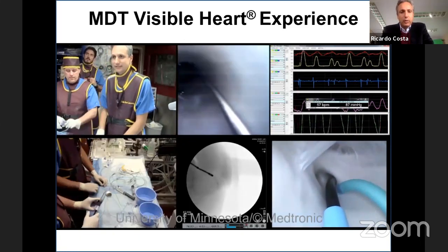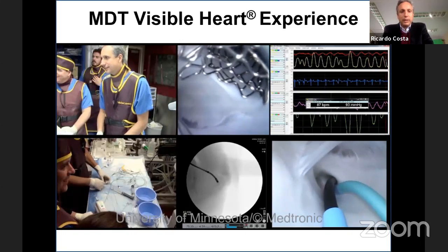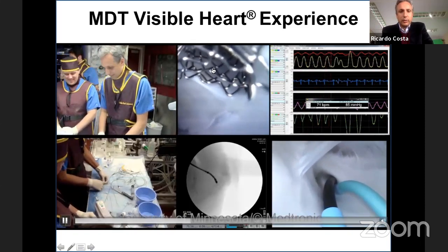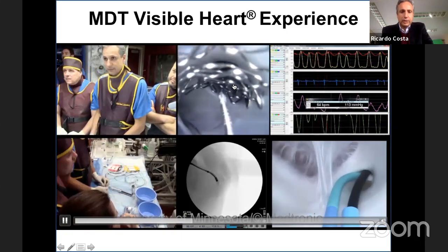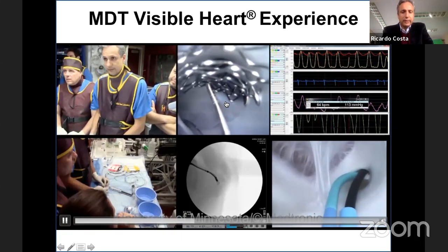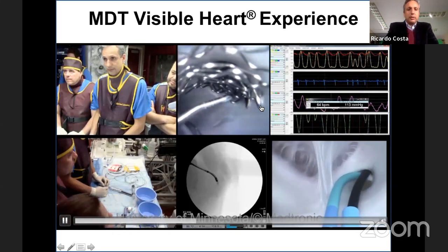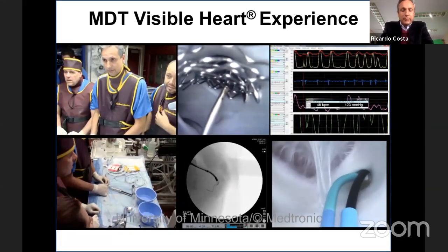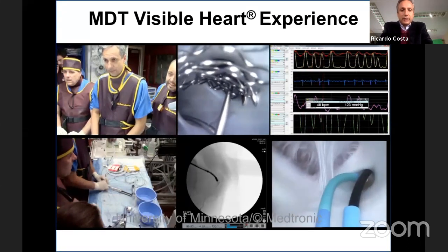So here now we have a complete crush, and that's where you see the ostium on the side. So this is a rewire, and that's the step that probably you're going to take. You might take more time, but that's saving your time for the second recrossing, the second kissing balloon.